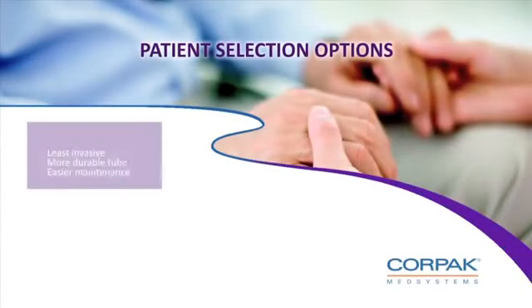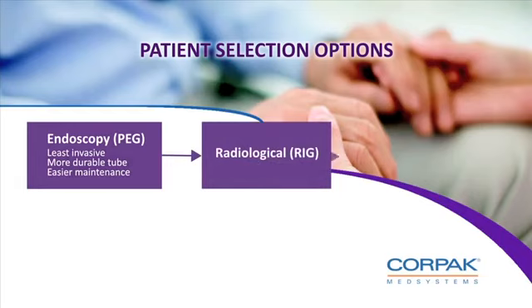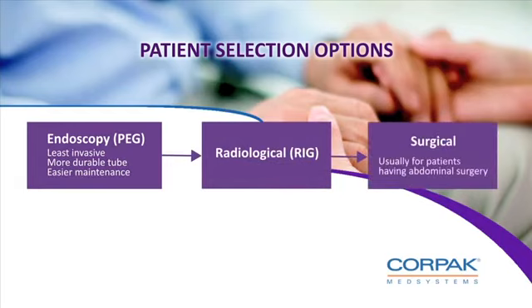For many patients, the procedure of choice would be endoscopic gastrostomy, or PEG. This is the least invasive and the tube used will be more durable and maintenance easier for patients and carers. Patients who can't have an endoscopic procedure will be referred for radiological placement or RIG. Surgical gastrostomies are usually performed if the patient is undergoing abdominal surgery.